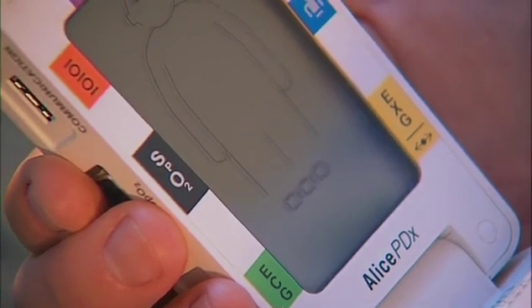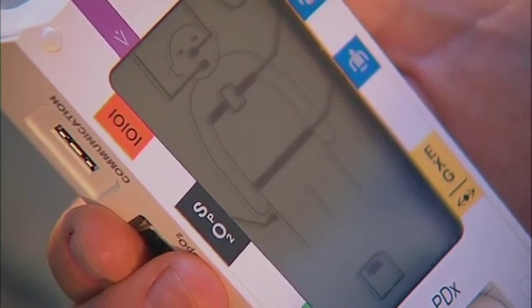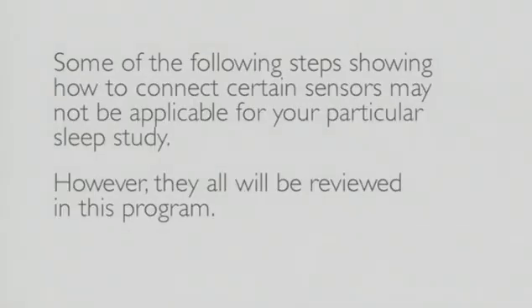Turn on the power button, which is located inside — press the button one time. While the device is warming up, circular icons should be moving across the bottom of the screen. The device display will flash to indicate which sensors need to be connected for your study. Some of the following steps showing how to connect certain sensors may not be applicable for your particular sleep study, but they will all be reviewed in this program.